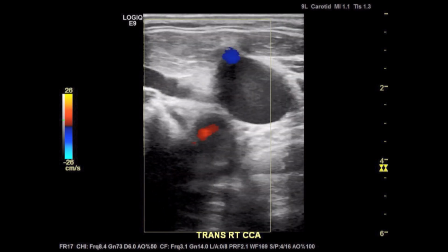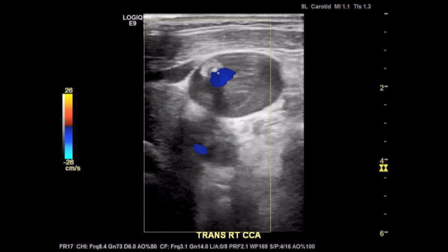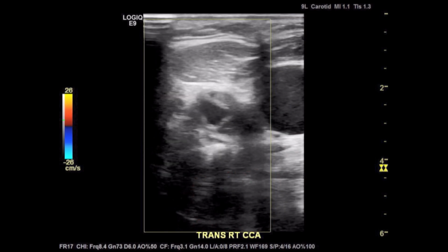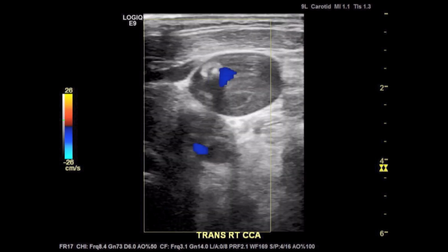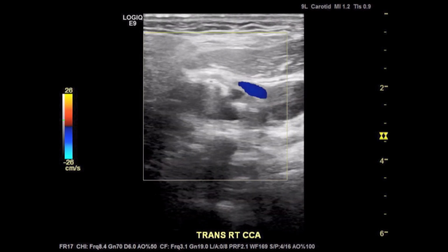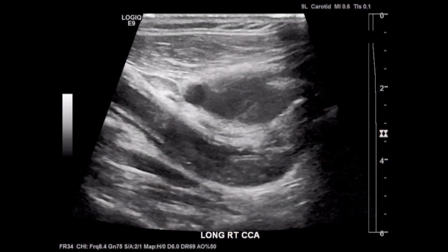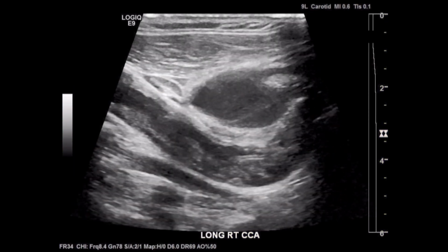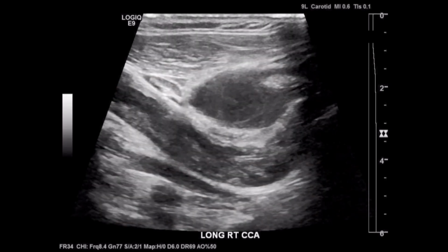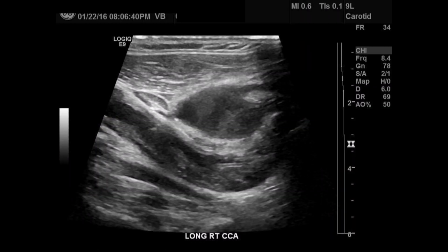The false lumen is already clotted up, as you see here. So that's already clot and no flow in that area. I want you to follow the subclavian, and hopefully we'll see some interesting picture in the subclavian in a moment. So the flap and the subclavian getting some flow. This is the clot in the right common carotid, and you see the flow is probably sneaking right there. And again, the IJ is puffing some clots as well.